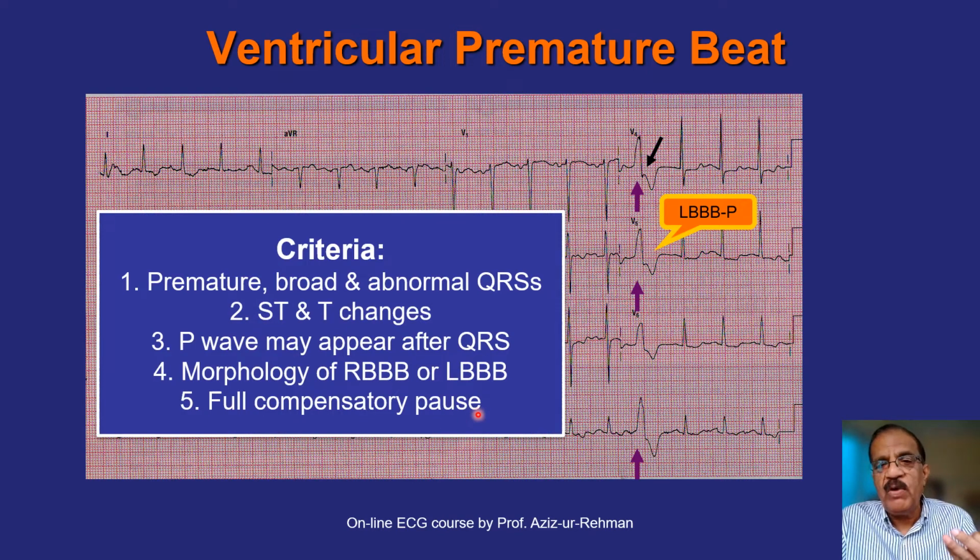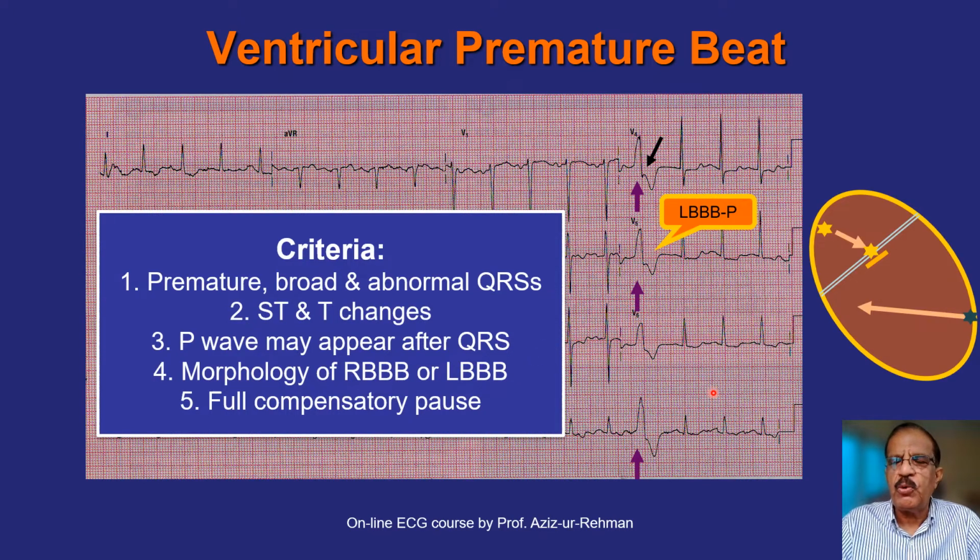And I told you when we were discussing APC that I would explain this concept later, because here we have to compare APCs and VPCs, atrial premature beats and ventricular premature beats. So I thought let me first do ventricular premature beats and then we will cover this concept. I think in the next couple of slides I will explain what is meant by compensatory pause. Now, to explain the concept further with the help of a picture, I'm going to show you this picture.